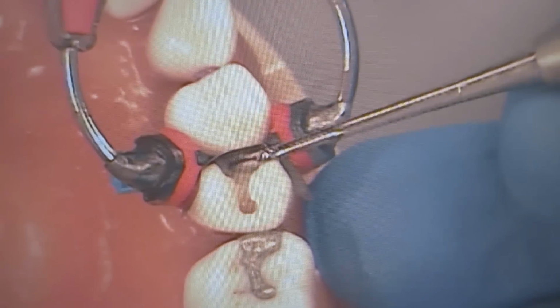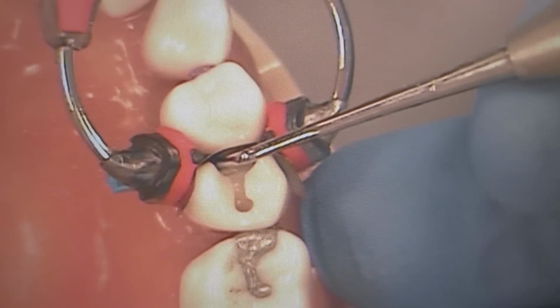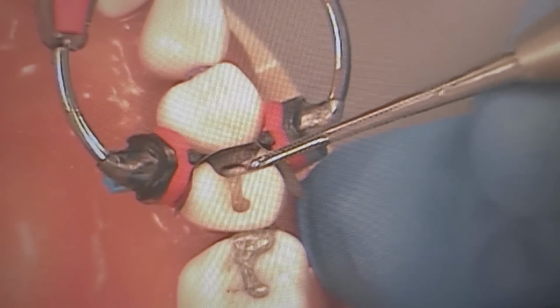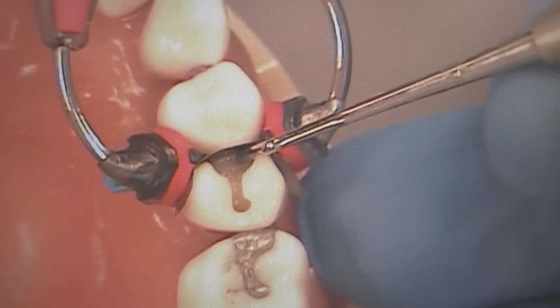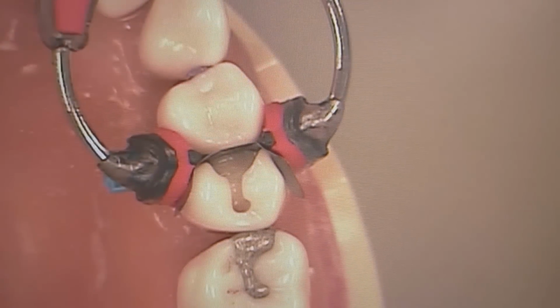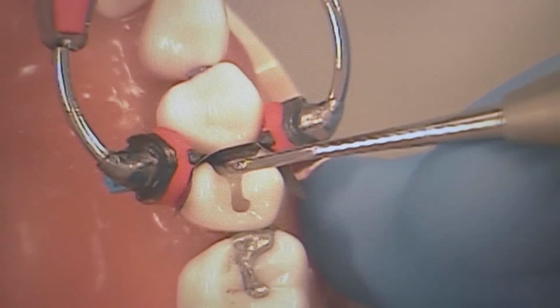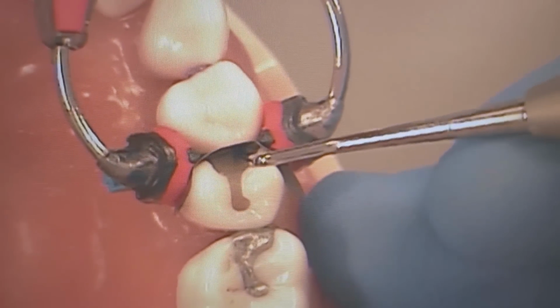Making sure it's well adapted to the proximal box or proximal walls. Dr. Chui, you like to put one full layer across the entire bottom of the box? I put a tiny layer, and I'm going to do an incremental layering after. My composite is just shy of the proximal wall, the pulpal floor.